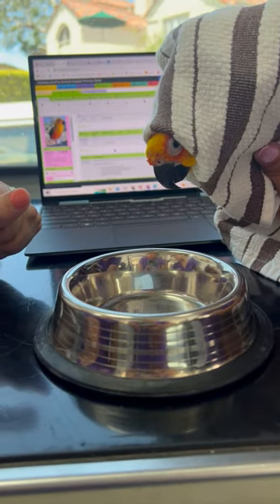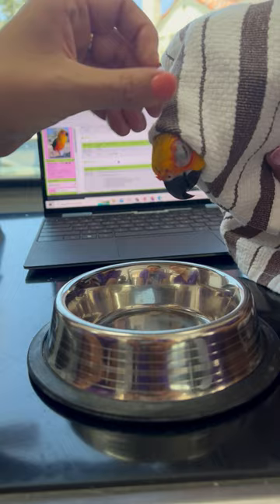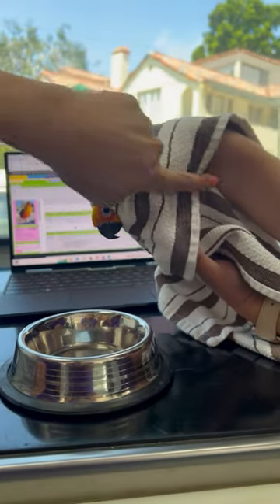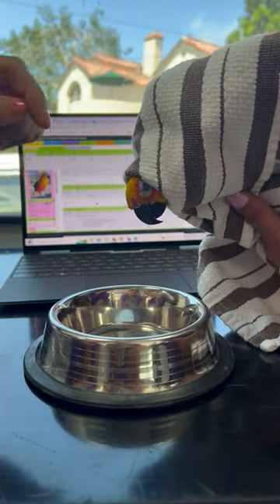We are about to do a nasal sinus flush on Pato here. Victoria has her restrained, her body is totally horizontal, because we want everything to drain down this way.